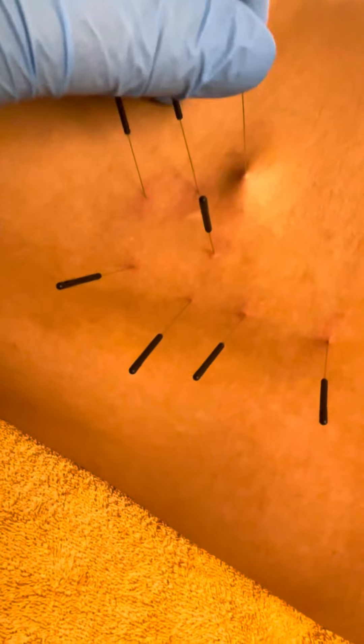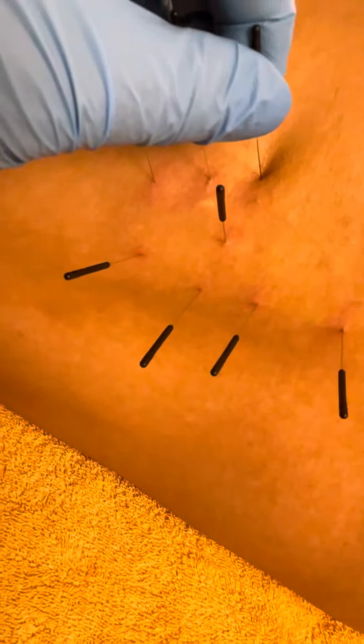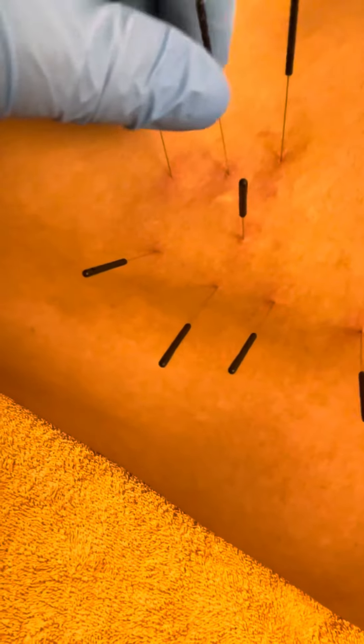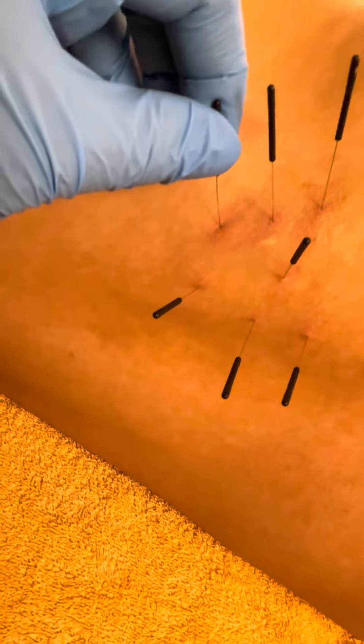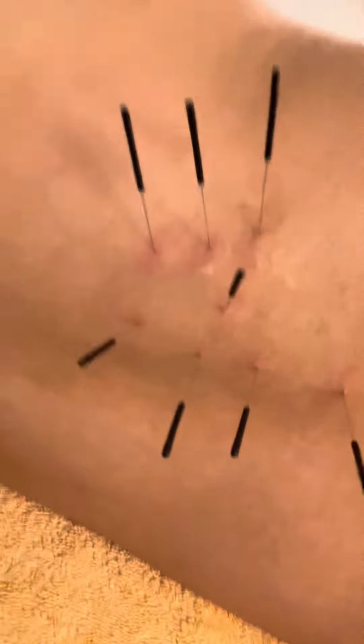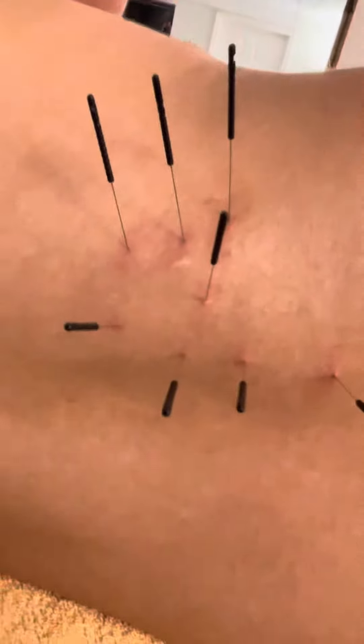This is called the pistoning technique in dry needling. Oh, that's a good one right there. You feeling these? Yeah. Good one. It's painless, see? He's just making those sounds for the fun of it.